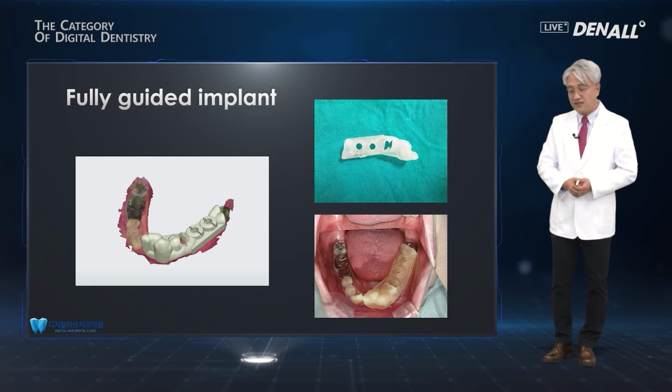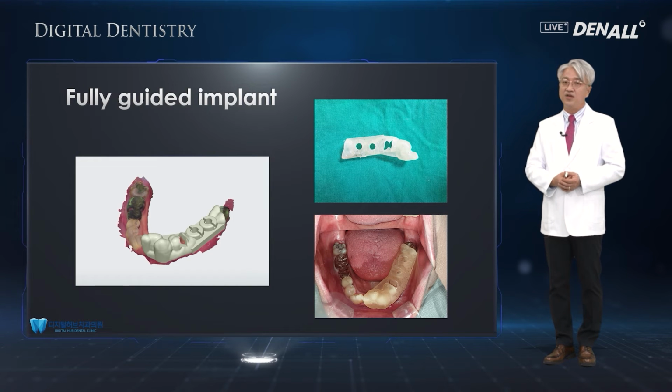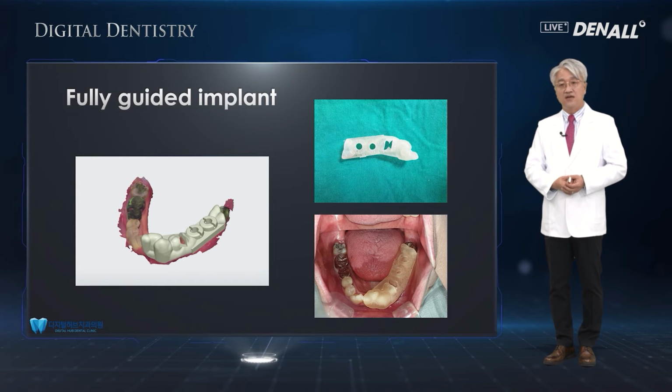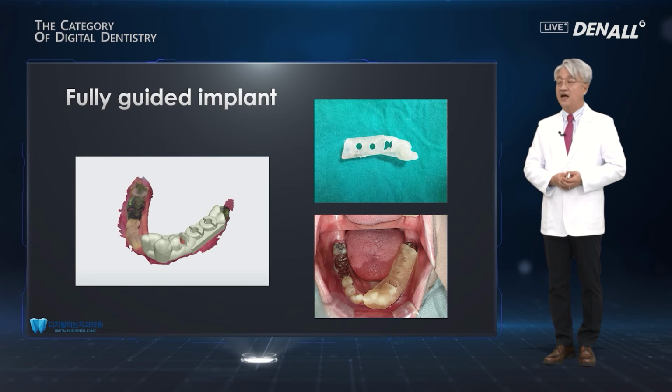Now in implant surgery, for digital implant guide surgery, Osstem's One Guide is used a lot. Using a 3D printer in your clinic, doing guided printing is another area that's very popular in digital dentistry.